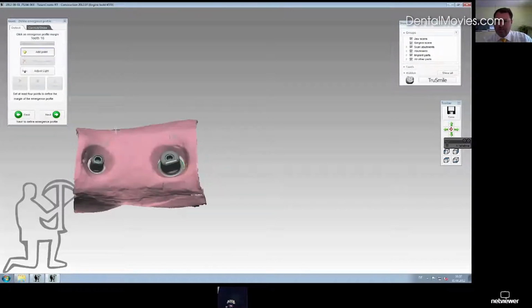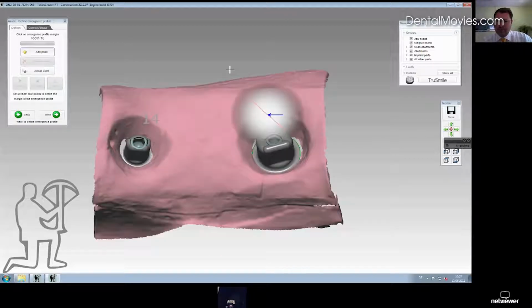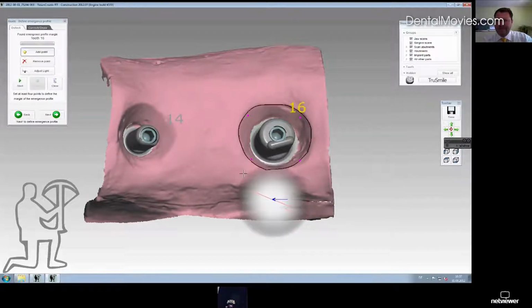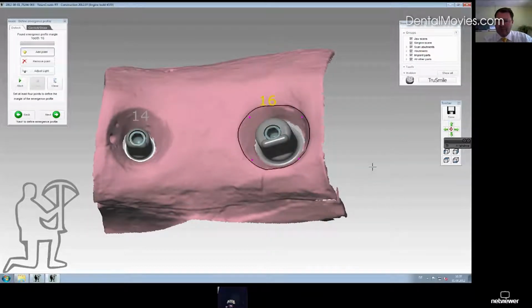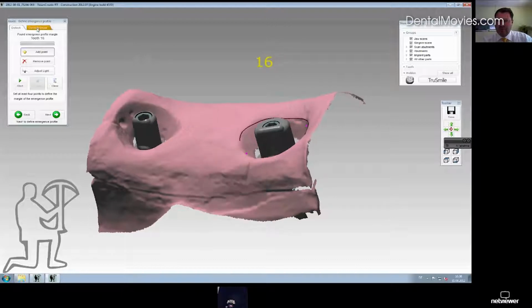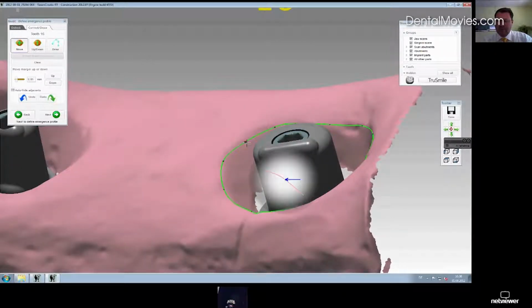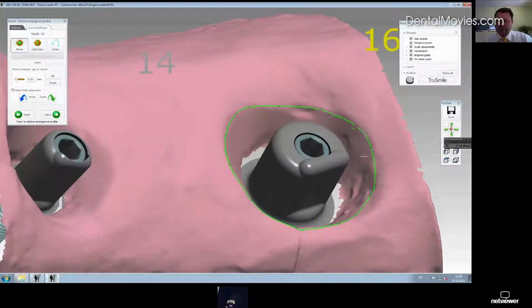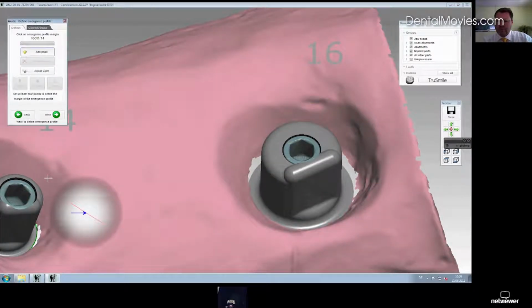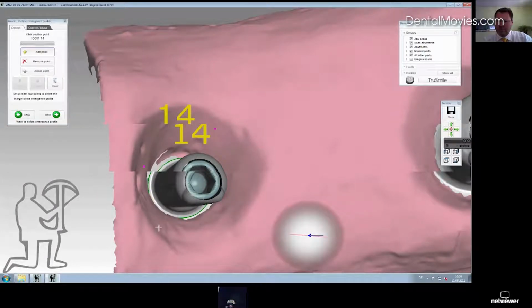Now the implant for tooth 1.4. Here it's the 3.3. Then test fit and go on. Here you set the emergence profile on the margin of 1.6, set 4 marks, and then there is a line, similar to the preparation line, and you can correct it or change it.